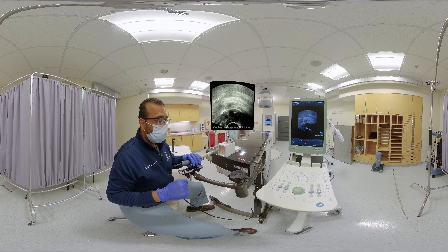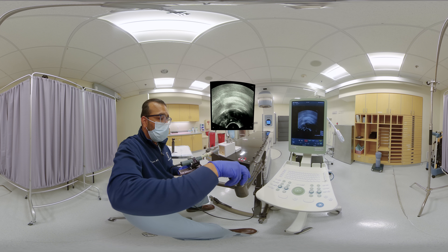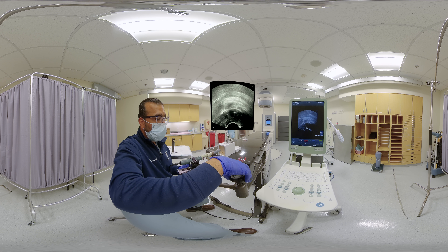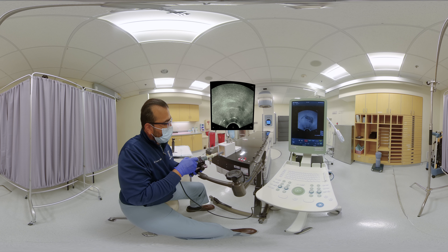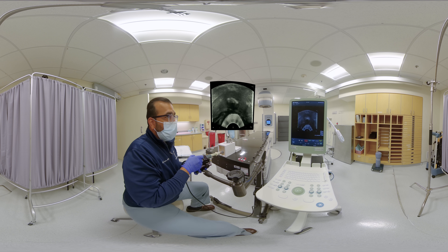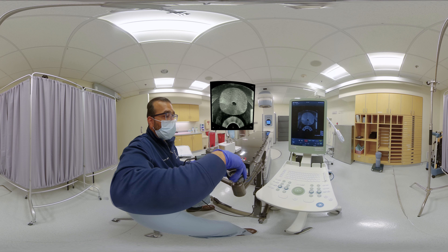I like to control the ultrasound with my left hand. We use an assistant to lock and unlock the stepper, but you can do this yourself if you choose. I'm going to insert the ultrasound probe with the buttons pointing up in midline to the patient with a slightly downward angle up until you get to the mid-gland of the prostate. I prefer to insert in the axial plane, but others may prefer to insert it in the sagittal plane. The mid-gland is roughly in this region, and we'll lock to take a look.